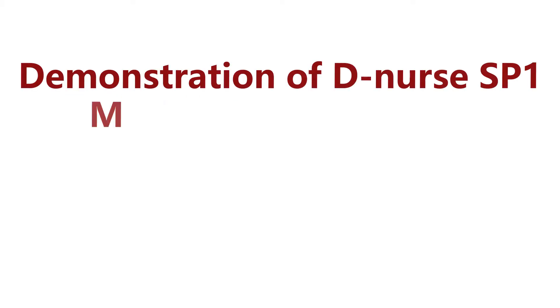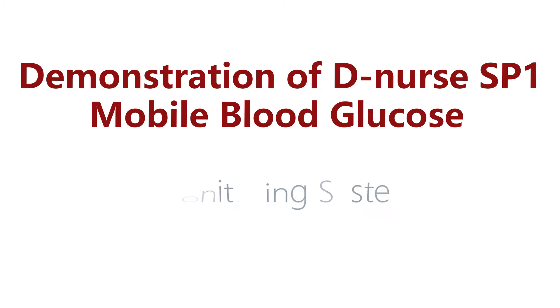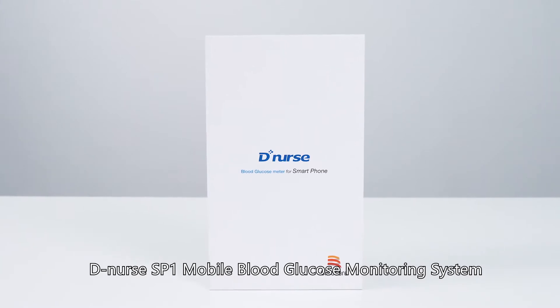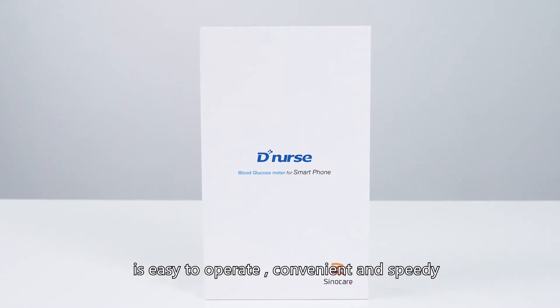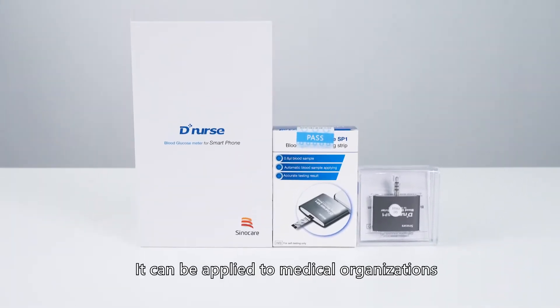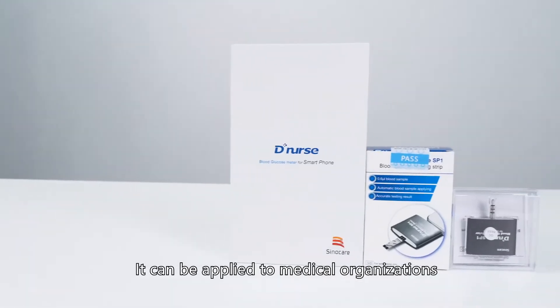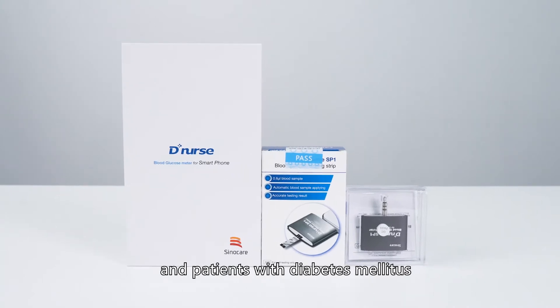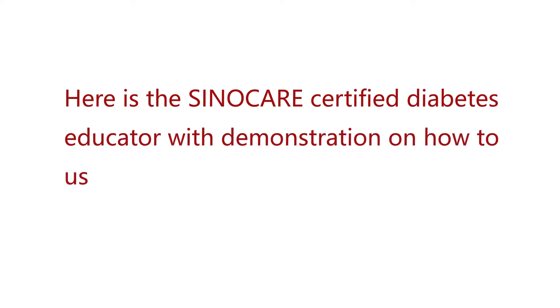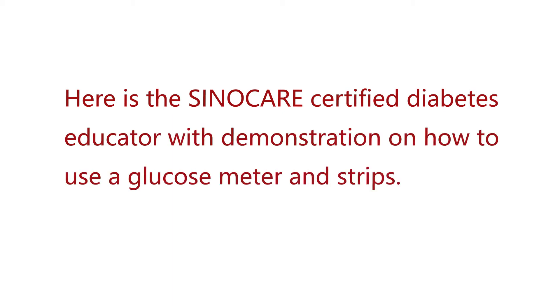Demonstration of DNURSE SP1 Mobile Blood Glucose Monitoring System. The DNURSE SP1 Mobile Blood Glucose Monitoring System is easy to operate, convenient, and speedy. The test results are accurate. It can be applied to medical organizations and patients with diabetes mellitus. Here is the SinoCare Certified Diabetes Educator with a demonstration on how to use a glucose meter and strips.